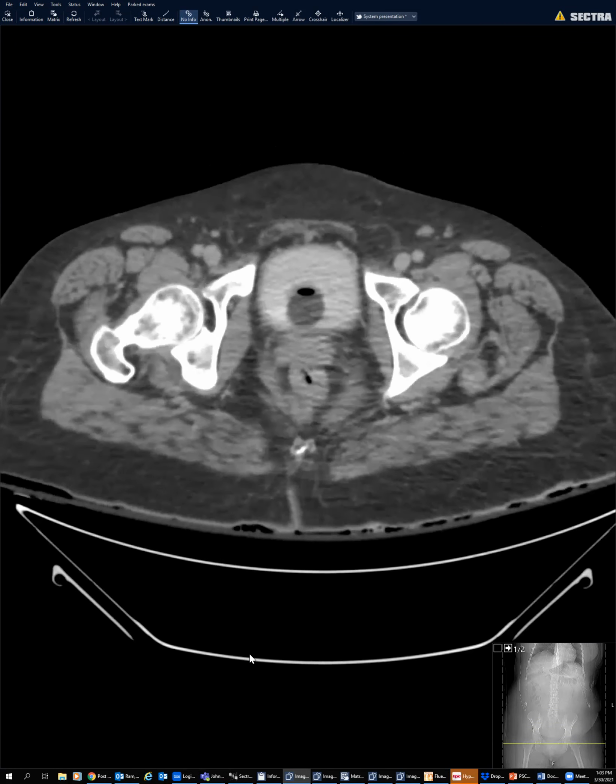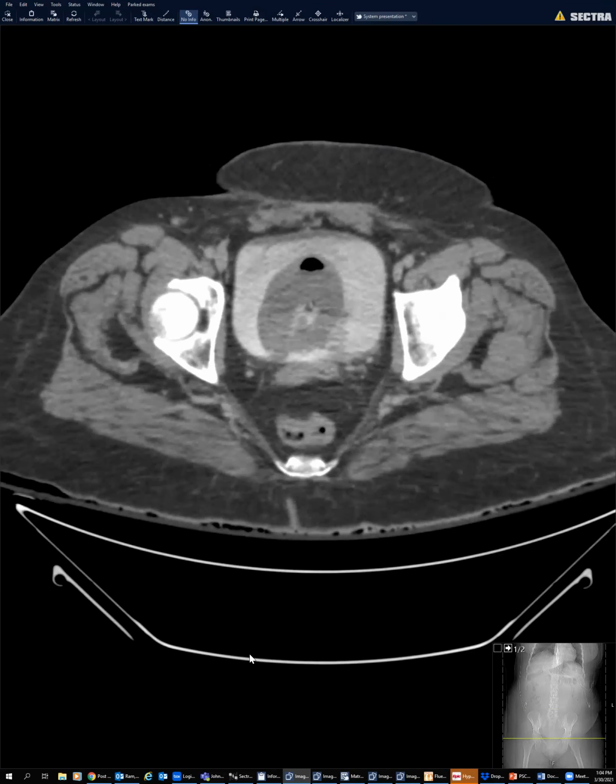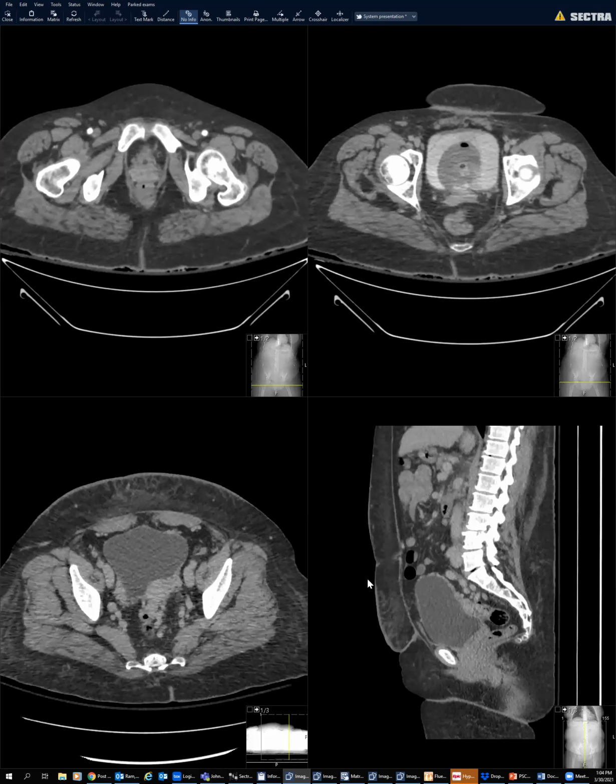Wow. I've never seen this. That's cool. I know. You see it in the stomach, like GI bleeding, gastric varices, but right. I wonder, it must be more difficult for them to get into the bladder wall. It must be. So, a few things.